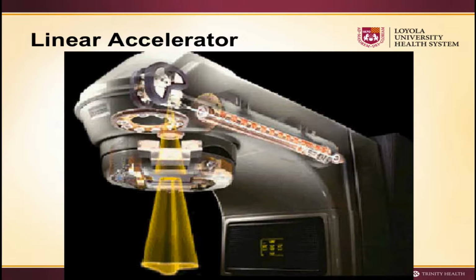So we can shape it into a square, and then before it comes out into a very customized shape in order to conform it for the patient. So here's a unique shape coming out. That is what actually the patient sees.